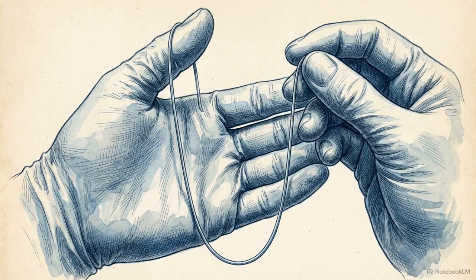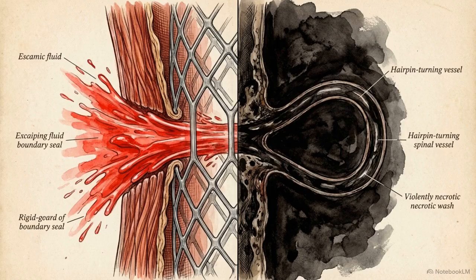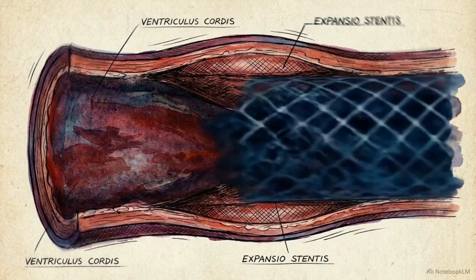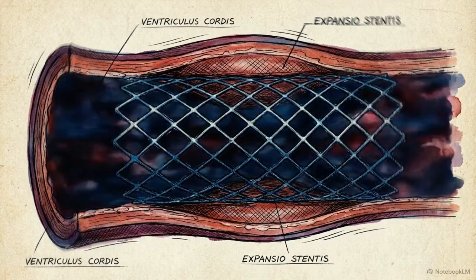We employ advanced alloys like nitinol because their thermal memory matches the physical demands of superficial, highly compressible environments. Massive aortic exclusions demand perfect mathematical geometry in the landing zones to avoid high-pressure endoleaks or spinal cord ischemia. Placing a metal strut into a human artery doesn't guarantee a cure. Long-term procedural survival depends entirely on the physician's ability to perfectly align that hardware with the unrelenting hemodynamic reality of the patient.